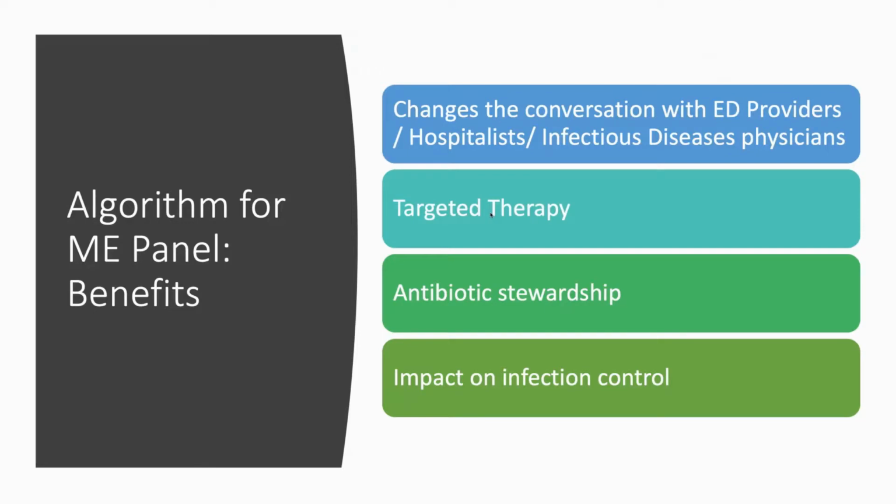Now, what did that algorithm do? Well, that algorithm completely changed the conversation that I have with an emergency room physician or with a hospitalist, right? They're not calling me as an infectious disease physician and going, okay, what are the tests you want me to order? What should we do here? What do you want me to start, right? The conversation we have is, hey, Dr. Siddiqui, we just did an LP. BioFire came back showing strep pneumo. Here's what I was thinking. What do you think? What should we do, right? Completely changes the conversation that we have regarding that patient.